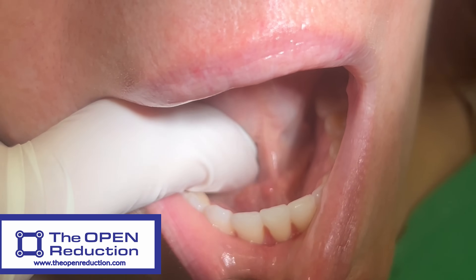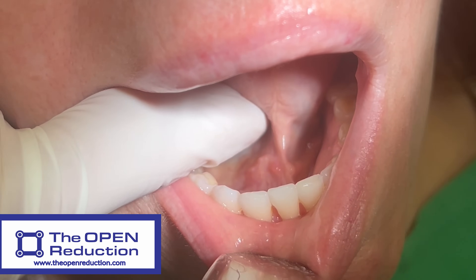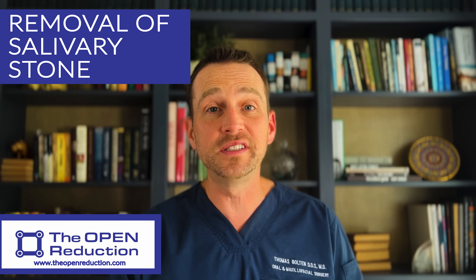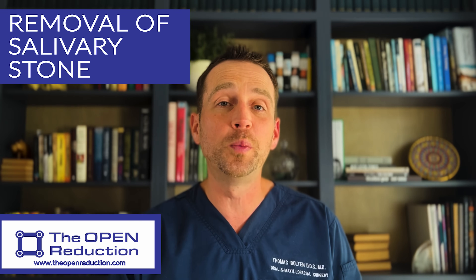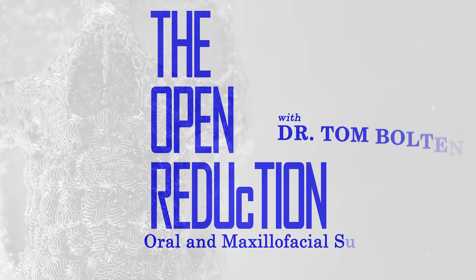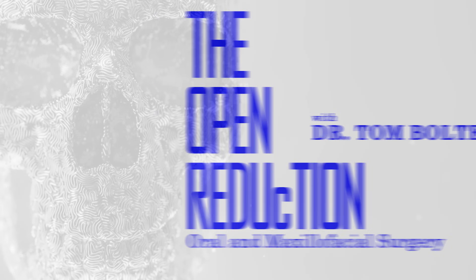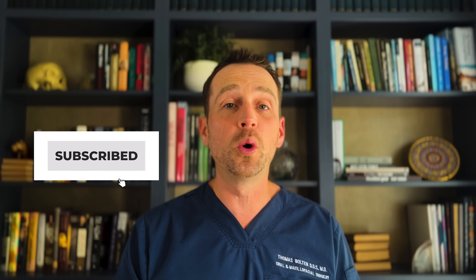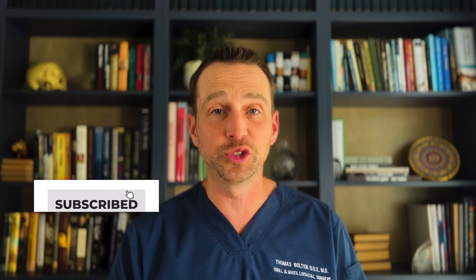A 51-year-old female has a hard lump underneath her tongue and pain while eating. Check out the full workup and surgery today on The Open Reduction — your channel covering all topics in oral and maxillofacial surgery.